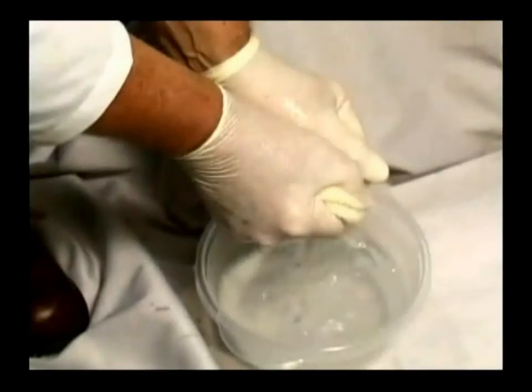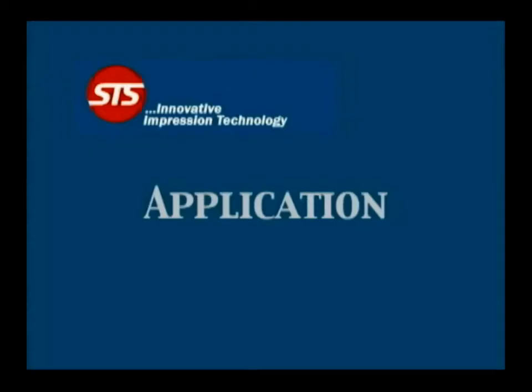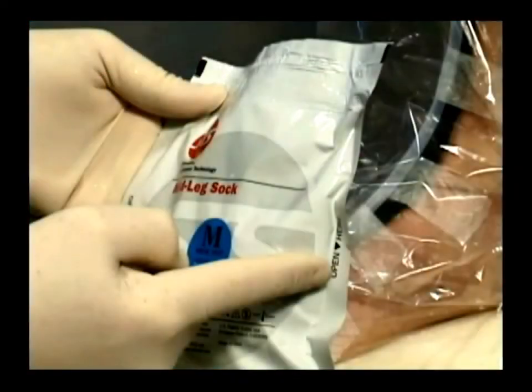Gloves must be worn when applying the STS socks material because the resin in the material will adhere to the skin. Care should be exercised to prevent the STS sock resin from contacting the patient's skin, clothing, and exam table during application. The plastic bags provided with the socks should be of sufficient length to prevent this from happening. Let's now move on to the application process. The pouch should not be opened until you are ready for application, since exposure to air will initiate the curing process.